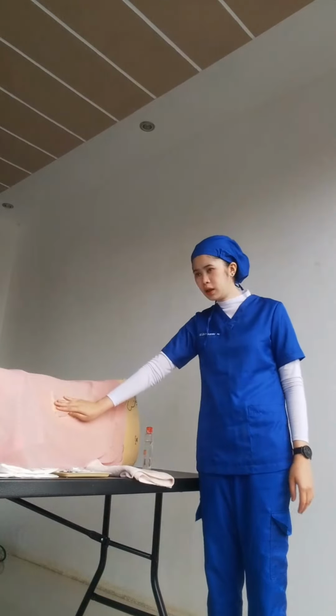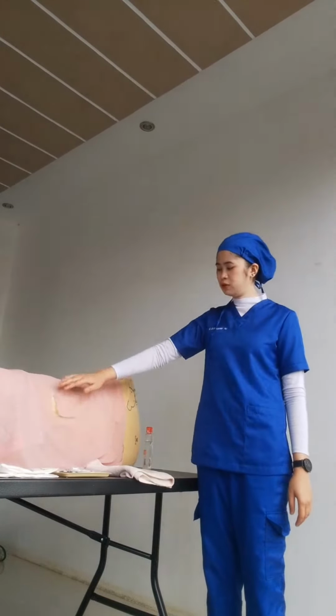The physician injects a local anesthetic to numb the puncture site, and then inserts a spinal needle into the subarachnoid space through the fourth and fifth lumbar interspace. This is the location of the puncture site.